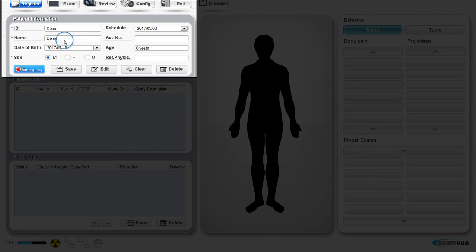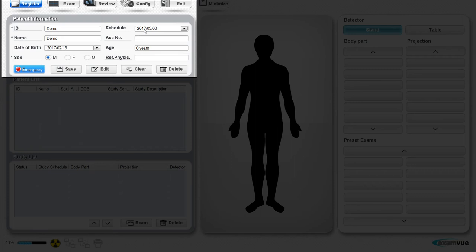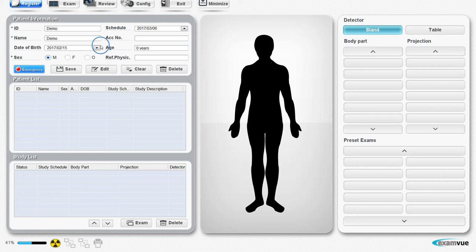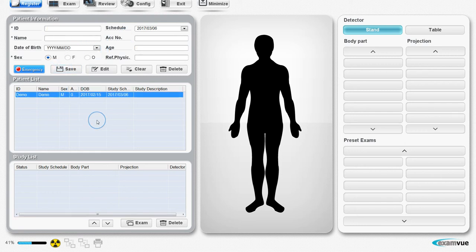Enter the name, sex, and date of birth, which you can select on the calendar or enter manually. You also have the option to schedule studies for the future and enter a referring physician. Age will be automatically calculated for you. Click Save to finalize the registration process.